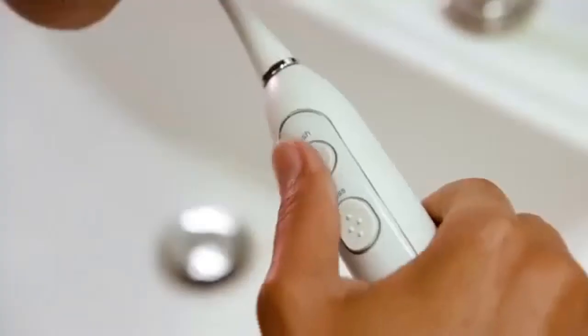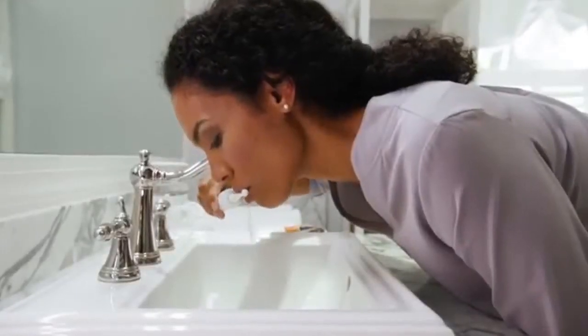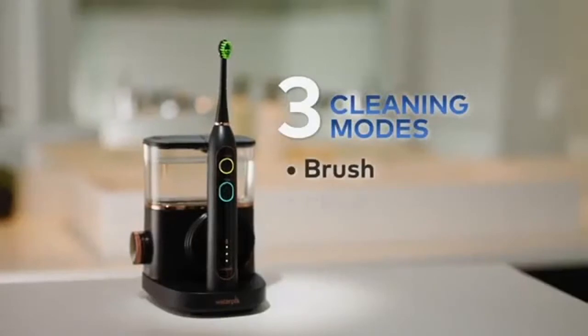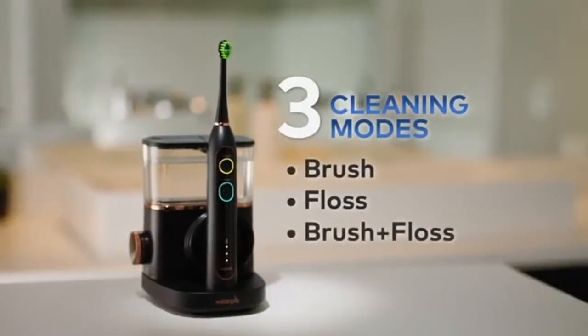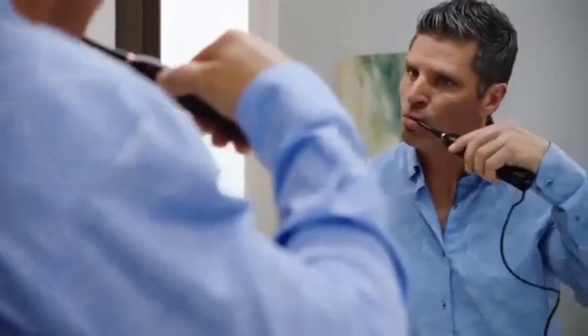After brushing, push the floss button and thoroughly clean between your teeth and below the gum line. You can even choose to brush and floss at the same time. There are three modes: just brush, just floss, or brush and floss together. Your oral care routine has never been more convenient.